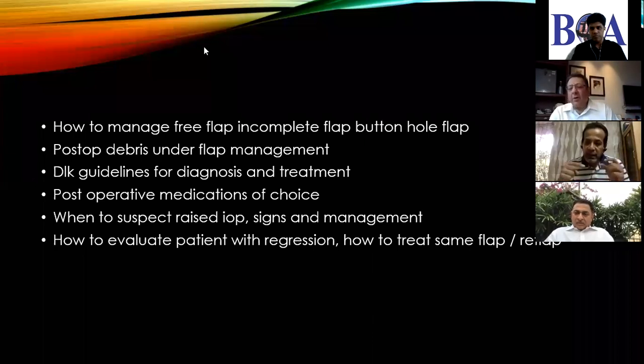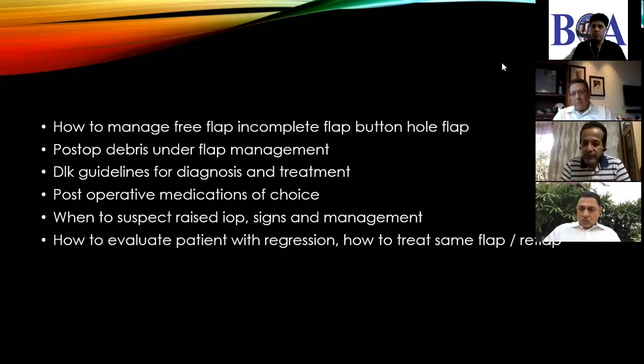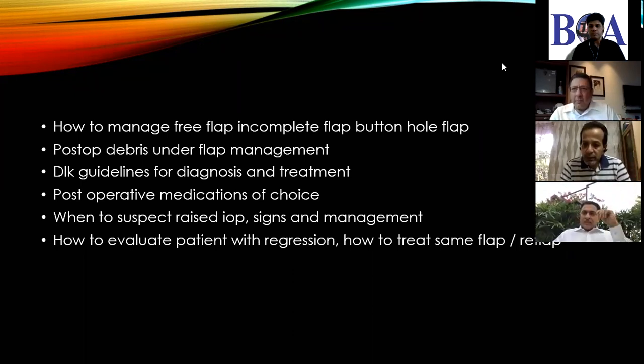You will. Sorry. Yeah, go ahead. Point is, in an incomplete flap, see to it that the optic zone is totally covered, totally opened up. If your optic zone is not opened up, do not do a LASIK in these cases. Yeah. Baja, you wanted to add something? Yeah. Now, this was a problem in the days when we had what was called the ACS, automatic corneal shaper. And to that end, I devised something called a LASIK shield, which I used to use again for every case. So there was no laser radiation that ever fell on the hinge.